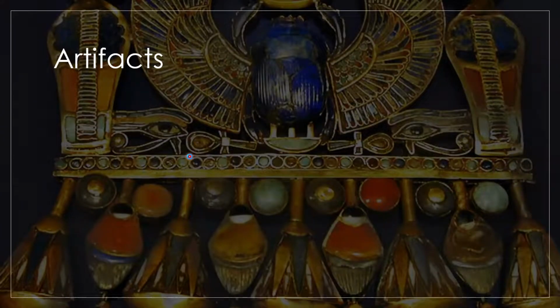So, artifacts. When we think of artifacts, we typically think of Egypt, the pyramids, things that we dig up, dinosaurs, things like that. But in sonography, artifacts include anything that doesn't correctly display the structures or the functions imaged. So an artifact is caused by some problematic aspect of the imaging technique.